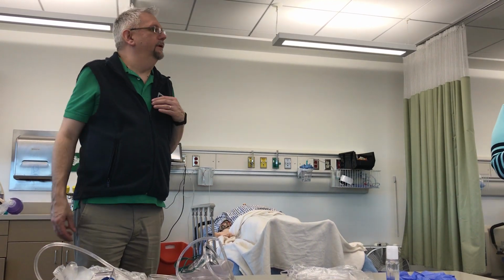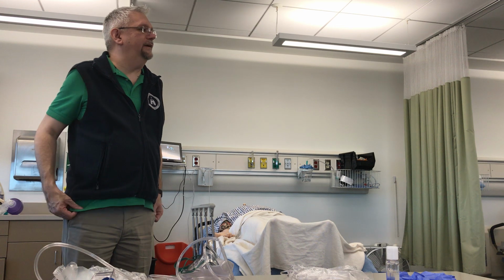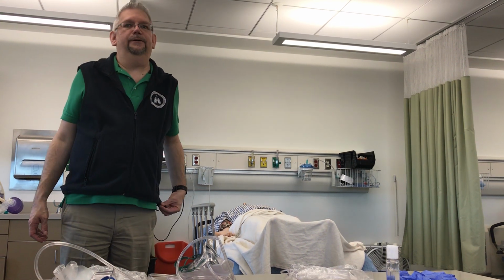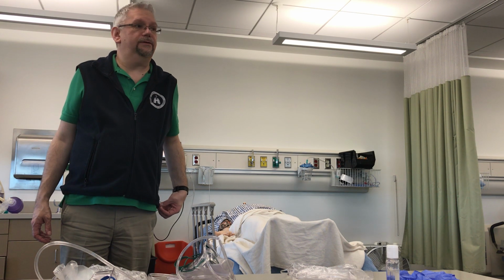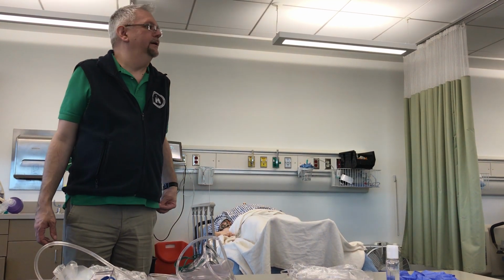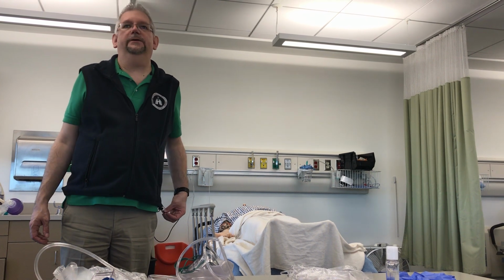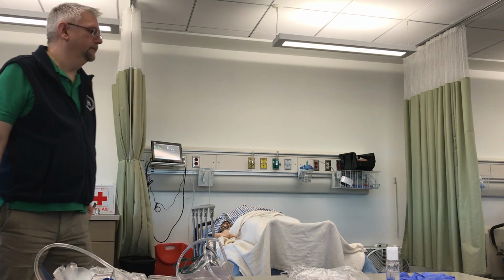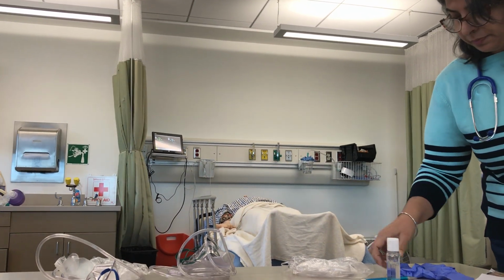His orders are to titrate supplemental oxygen to keep a SAT greater than or equal to 90%. Okay? And he also has an order for Q4-PRN albuterol, 2.5 milligrams, to be administered via small volume nebulizer. Okay? And so here he is.